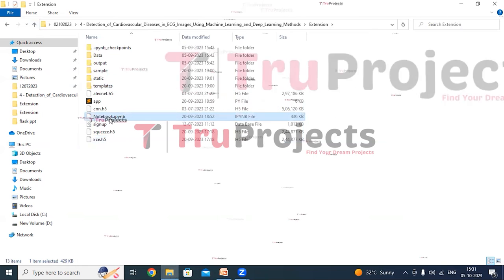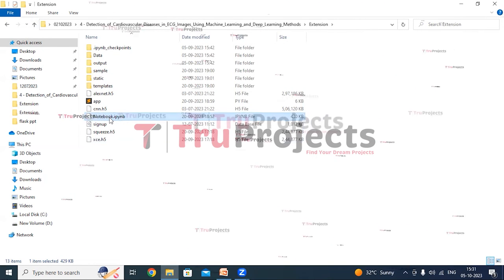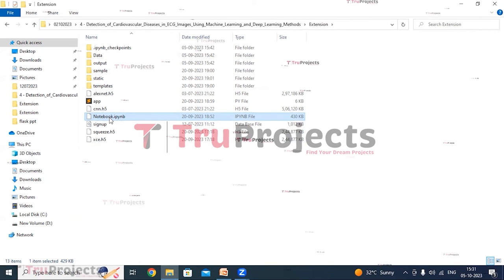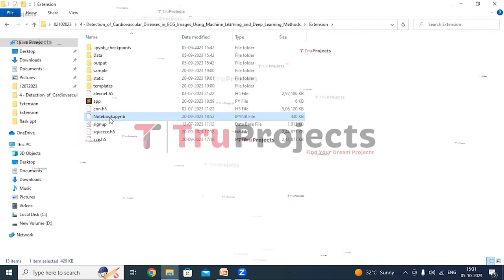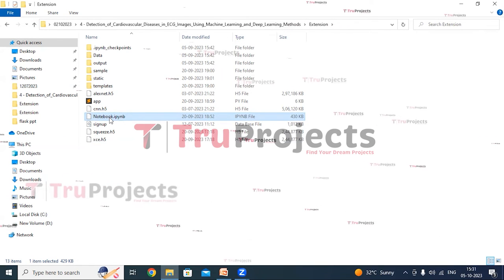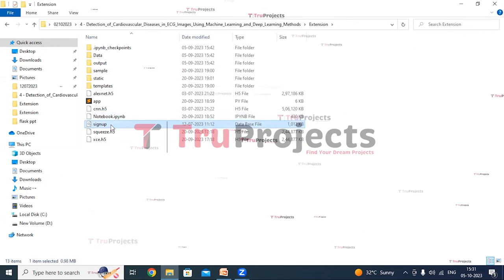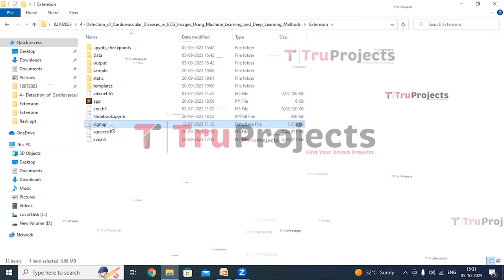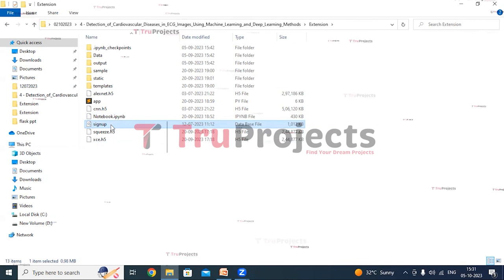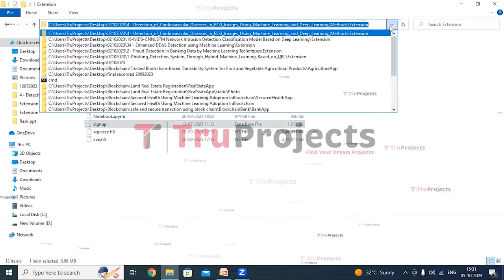The notebook.ipynb file is a Jupyter notebook containing a combination of code, graphs, and outputs all in one place. It allows users to write and execute code in individual cells, making it a popular choice for data science. The signup.db file is the database file used to store user information. Now copy the path of the code folder from the address bar of the file explorer.